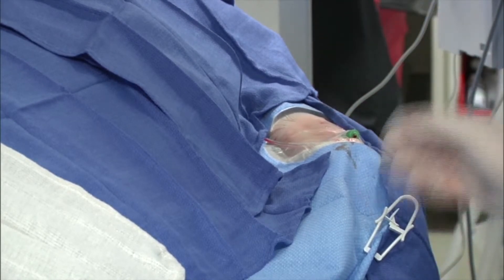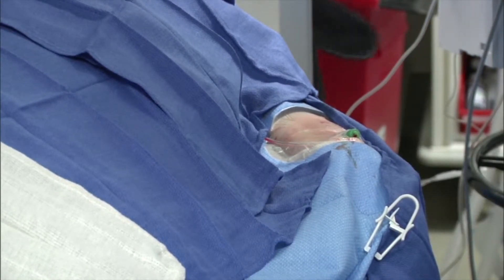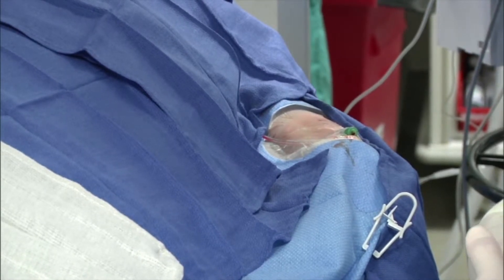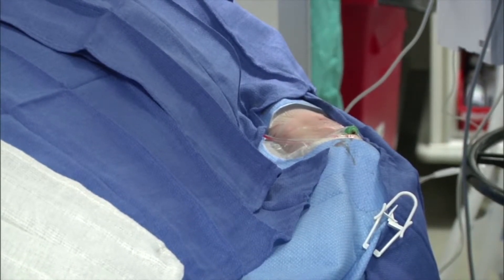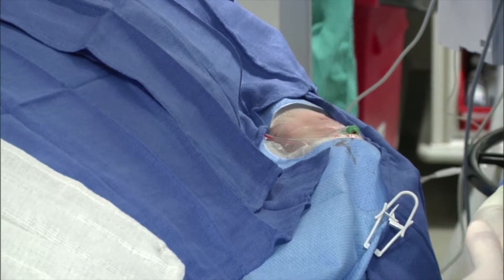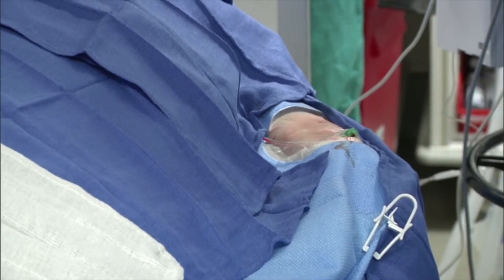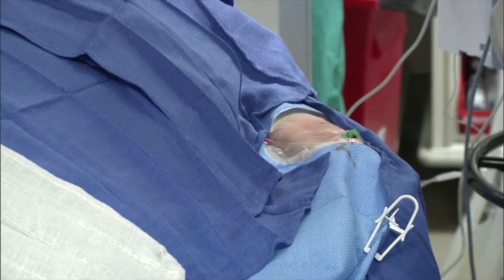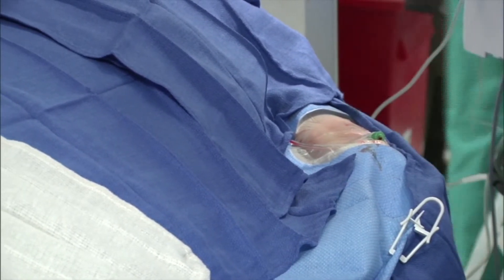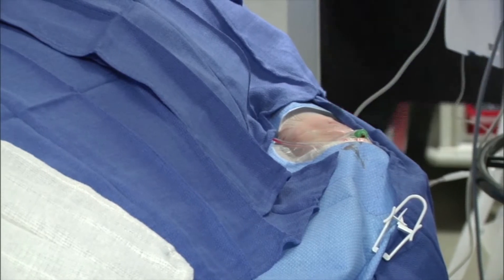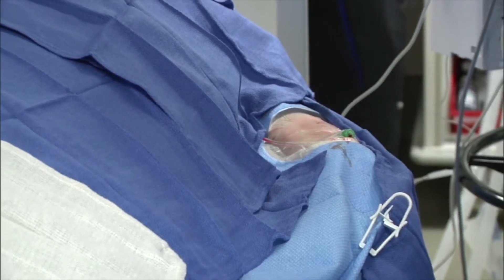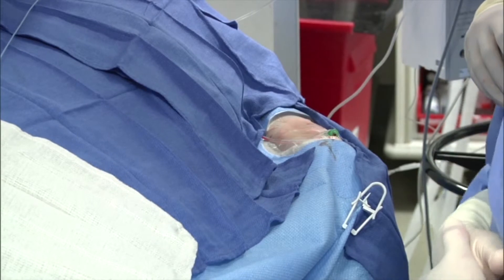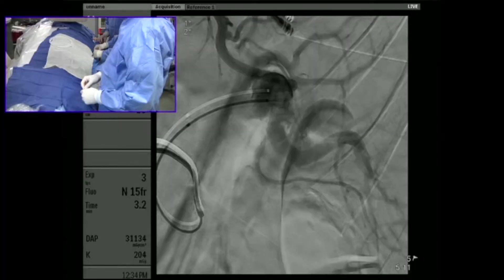I've already accessed the left radial artery using a Glide Sheath Slender. We chose the slender because we'll probably use a 5 French diagnostic catheter but want the option to use a 6 French guide catheter if needed. We've given our standard cocktail: 3,000 units of heparin, 200 micrograms of nitroglycerin, and 2.5 milligrams of verapamil.